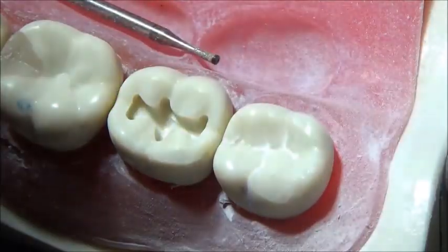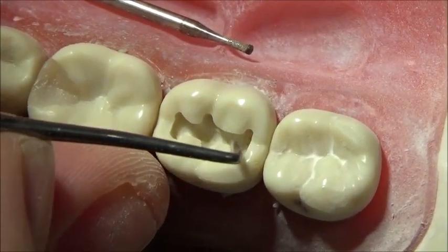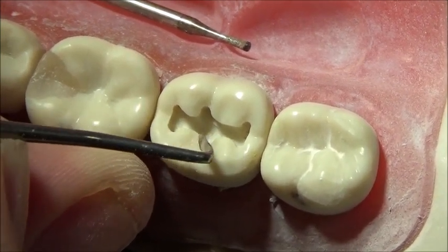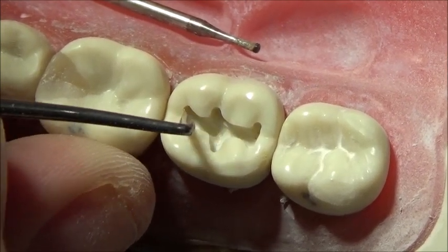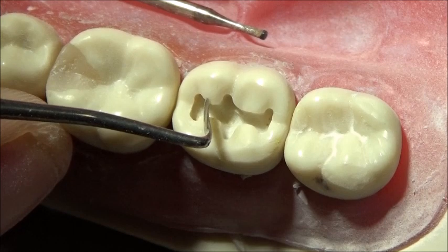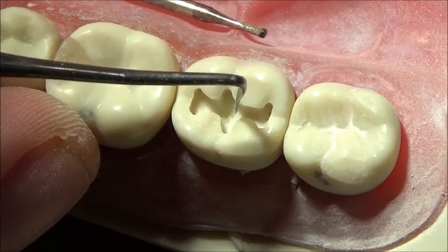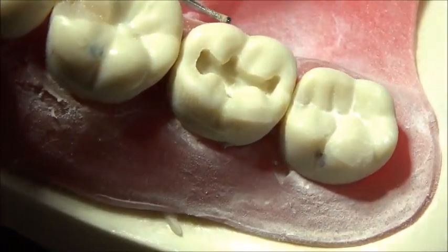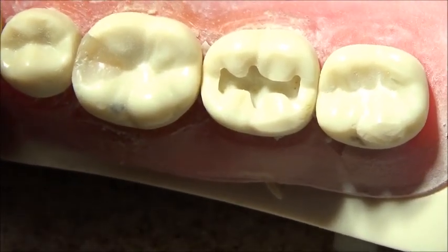One thing to keep in mind is having a nice flowing outline form. You want a very nice flowing outline form so that whenever you place the restoration — be it amalgam or composite — you don't have to guess where the finish line is. You can see how nicely flowing this is all the way around; there are no jagged areas, the outline curves are smooth. This is about what you'd want for your class 1 on a mandibular molar.